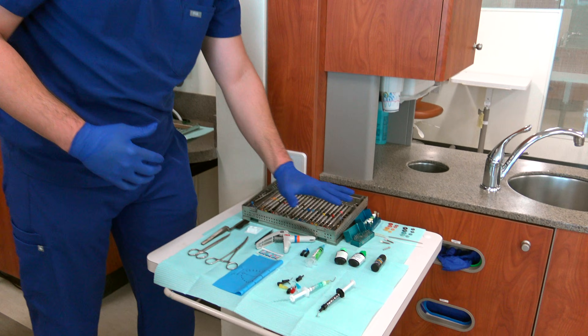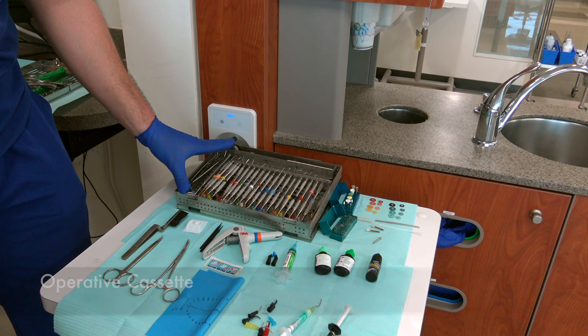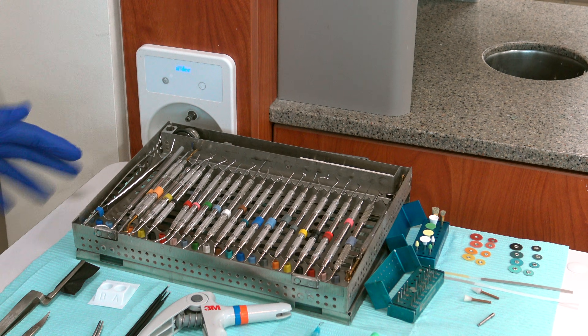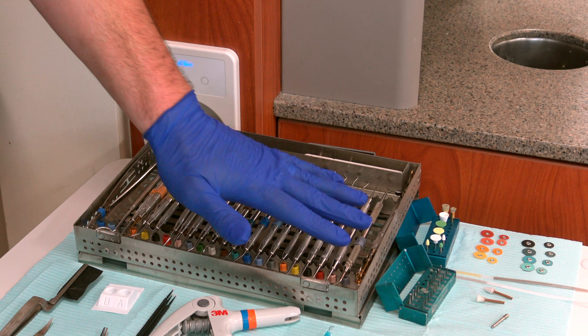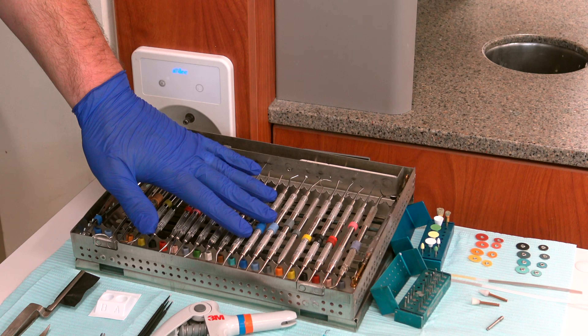What you have here is your operative cassette. Anytime you do an operative, whether it's amalgam or resin, a core buildup, whatever, you're going to have to check out this operative cassette. It comes with everything you need — from cotton forceps, mirror, explorer, your carvers, your burnishers, your amalgam loaders — but it definitely has what you need, especially these burnishers for the composite.